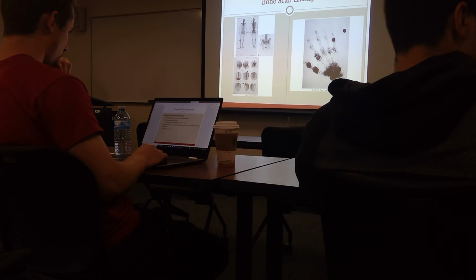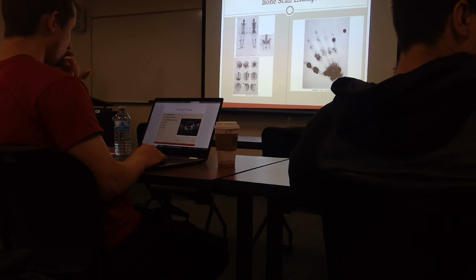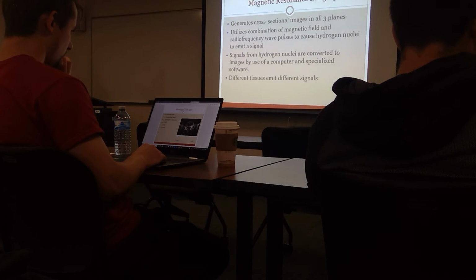Plus, it goes on patient history. Do they have a history of tumor that may have come back, and they're isolated to one area? So there's a lot more that goes into it. You don't get it just by this. But this helps you determine where what we call hotspots, where the increased metabolism really lies. Again, we can't make too many inferences from the imaging, but it does give you some locality, and a good physician would say, all right, we need to do more testing, and let's find out, is it OA, is it a tumor, and they'll use all of it.